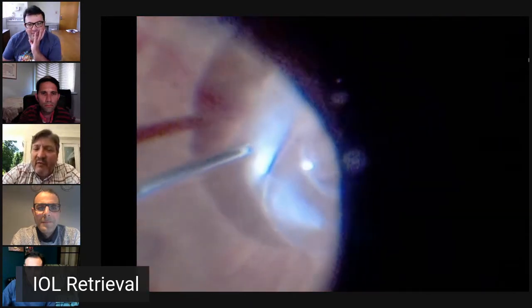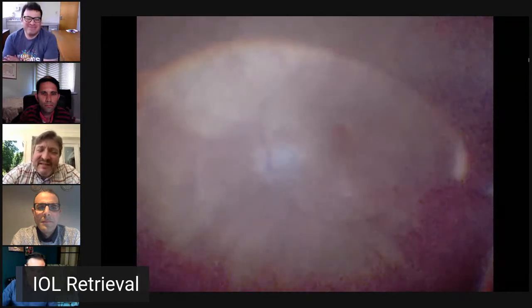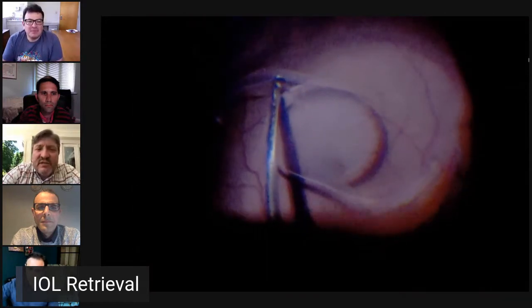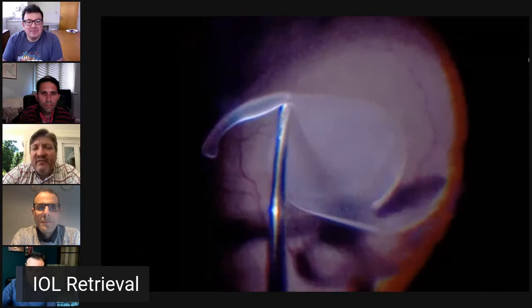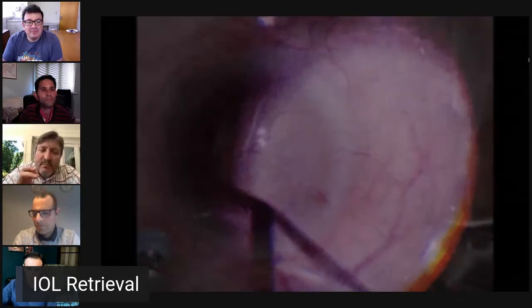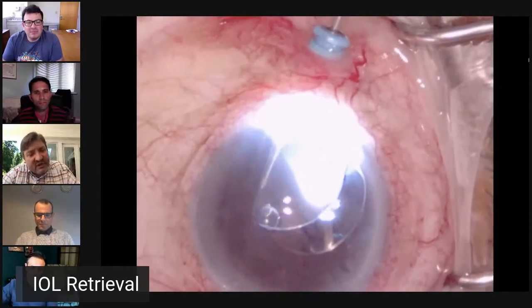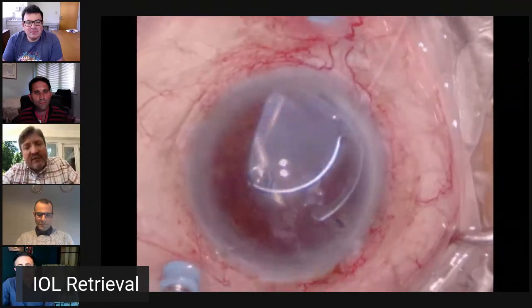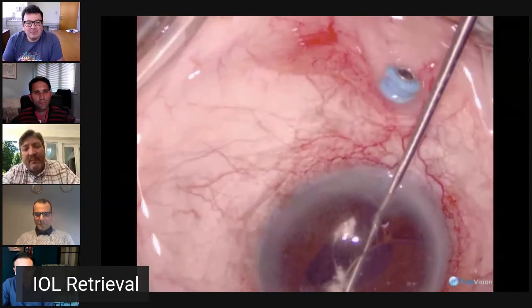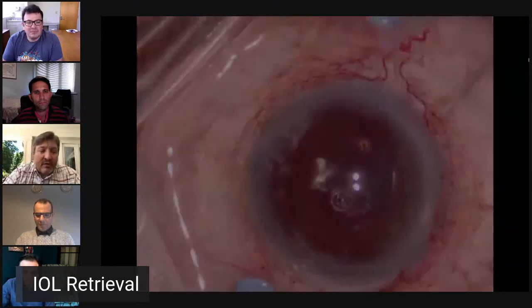Since then, I've migrated towards using the forceps the way Dr. Salem just showed, but I've even stopped using the forceps. I just use suction from the cutter now, and that's very, very powerful. As long as you put the mouth of the cutter into the optic-haptic junction, you can bring the IOL with just suction from the cutter up into the retropupillary space and then use a light pipe to push it into the anterior chamber. It's very nice, it's very powerful, and it works really well.